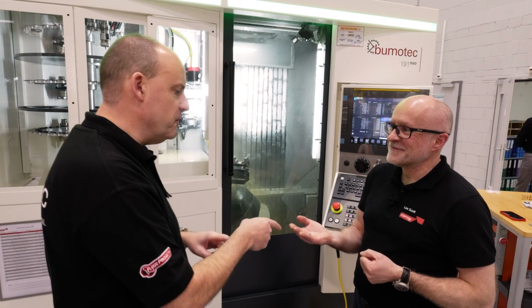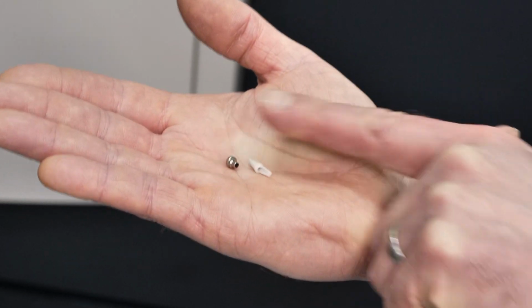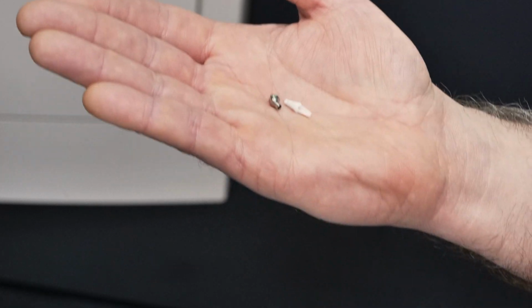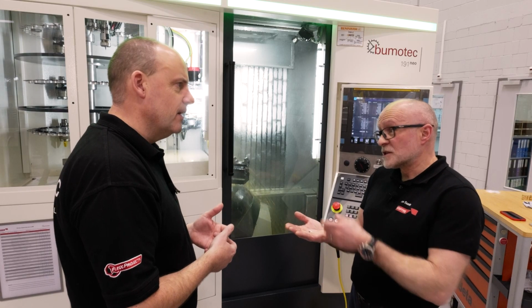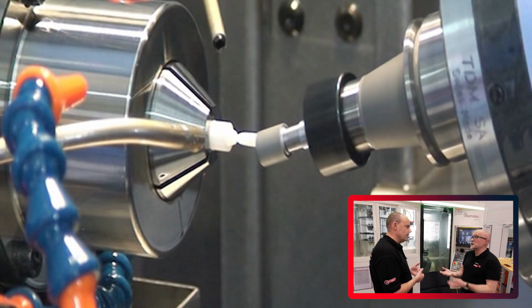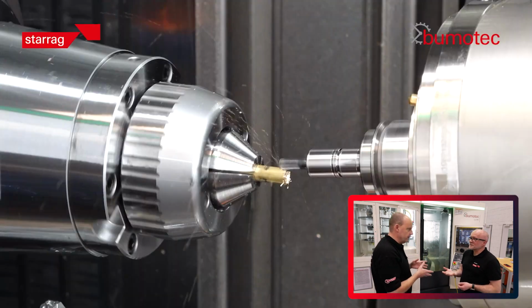Okay, now there's two different materials there though, so if they're two abutments, why are these two different materials? Sometimes they're made from titanium, so the metallic part is titanium, sometimes they're made from ceramics. So with ceramics, we'll grind the whole abutment. With titanium, we'll turn it, drill it, mill it if we need to. And these are being made on a Bumotec 191 Neo.